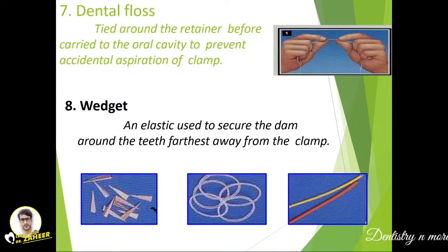Dental floss is tied around the retainer before it is carried into the oral cavity to prevent accidental aspiration. A wedge, which is an elastic, is used to secure the dam around the teeth on the distal side — the farthest side from the clamp.